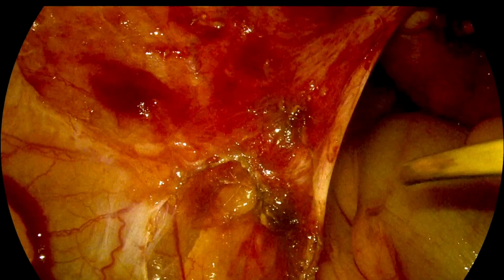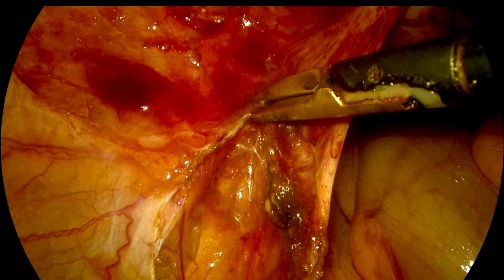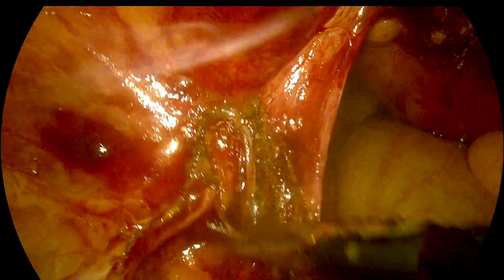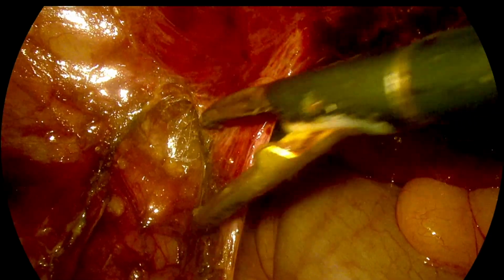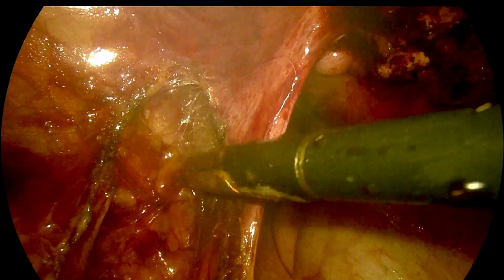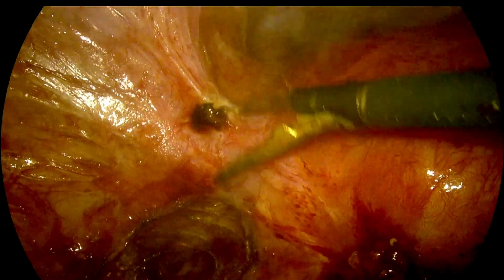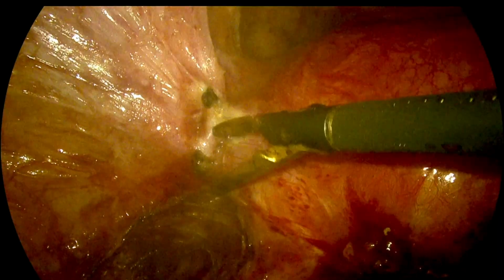Slowly, we are trying to open the peritoneum covering the sigmoid, between the sigmoid colon and the round ligament. We are going deep down. Here we can see a band of tissue which appears like the infundibulopelvic ligament, but actually it is a fibrotic band. But to be on the safer side, we are identifying the ureter first and then we will divide this band of tissue after confirming the location of the ureter.